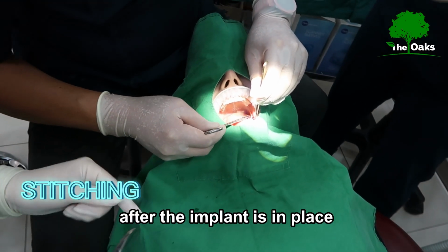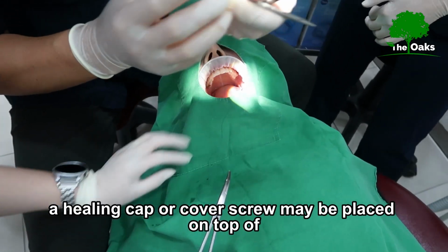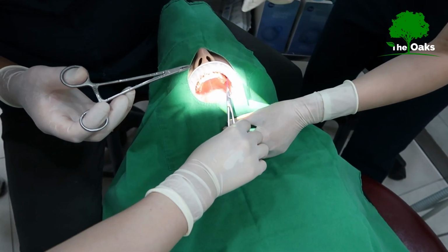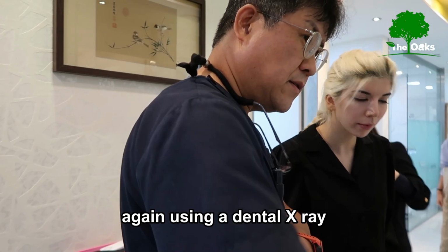Stitching. After the implant is in place, the gum tissue is stitched back together. In some cases, a healing cap or cover screw may be placed on top of the implant to protect it during the healing process. After the stitching is done, the doctor will now recheck your teeth again using a dental x-ray.